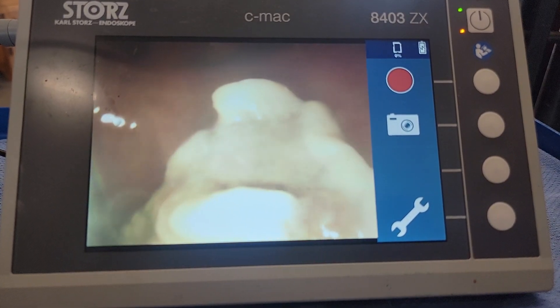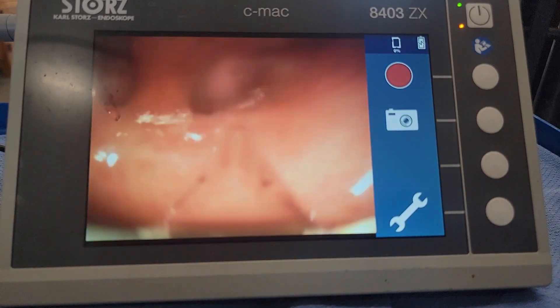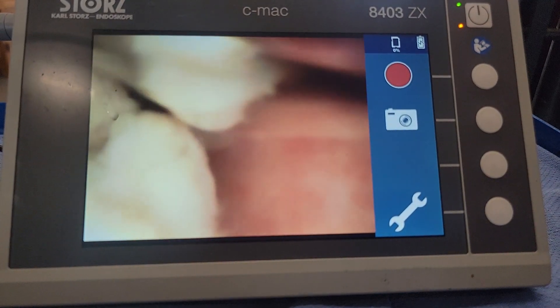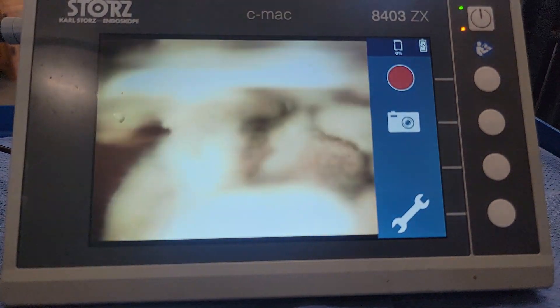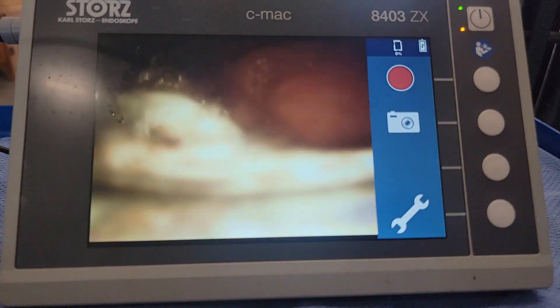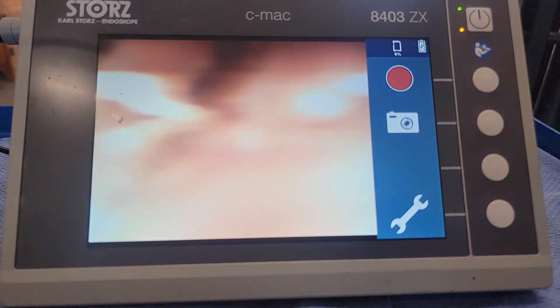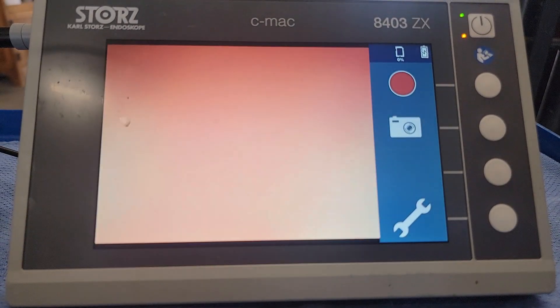If they're on antibiotics long enough and the sinusitis has been going on long enough, even if you actually remove the bad tooth, you're still stuck with pus like this in the sinuses. You actually have to go in and remove this pus either surgically or, like what we're doing here, flushing it out.